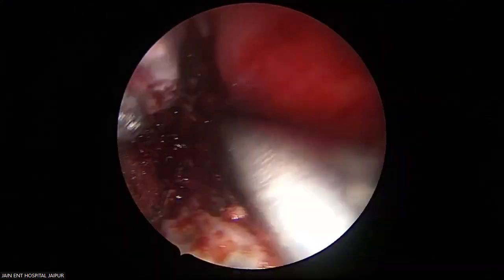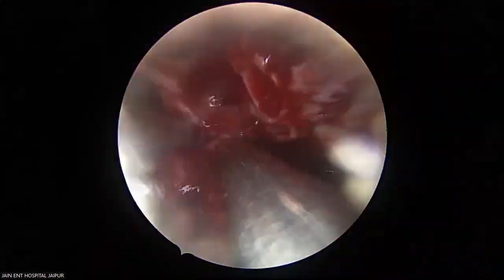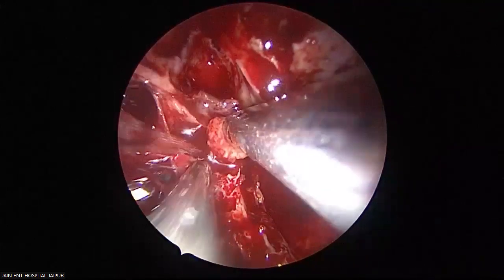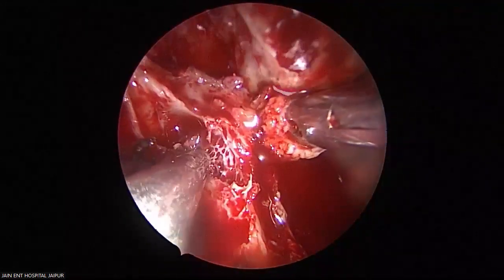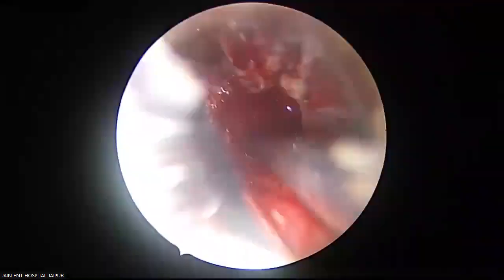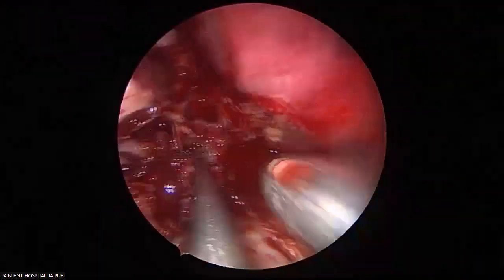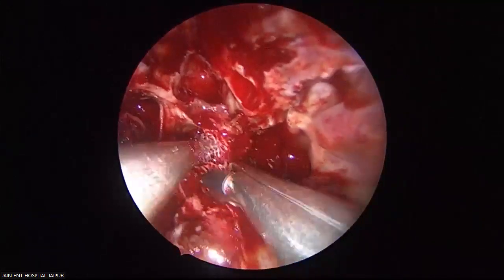Just to show you, the pterygoid bone. See the tumor? Don't break it. See this, it should come out intact. Can you see? And see the nice honeycomb bone, the free bone. That is how a pull is. A controlled pull to selectively remove the tumor without breaking it. Could you see the movement? How it was pulled? That's a very controlled movement.